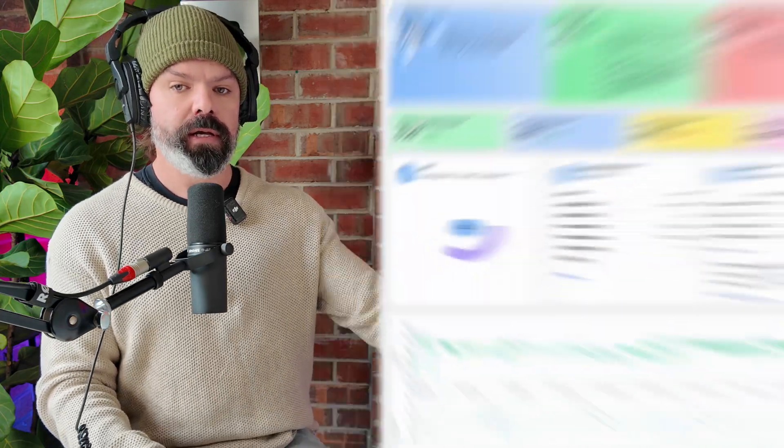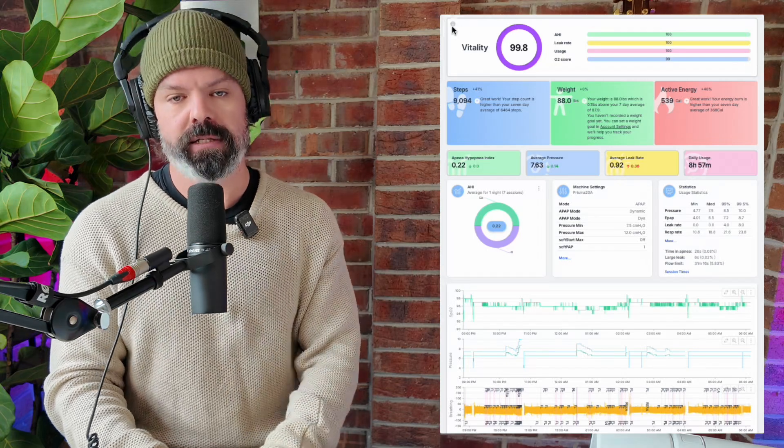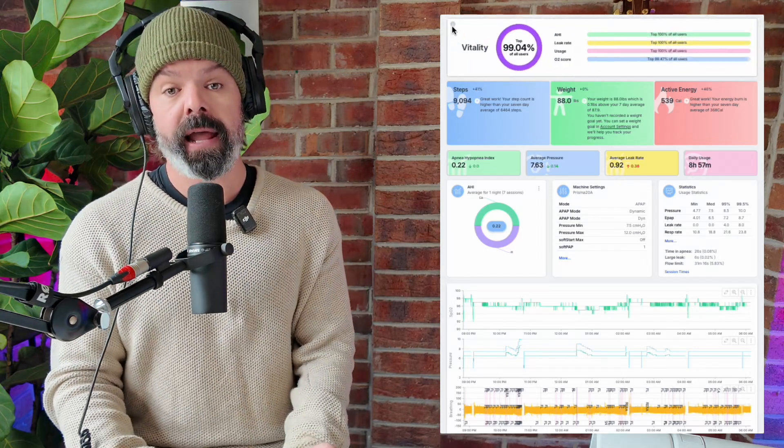G'day, my name's Nick, and today I'm gonna walk you through the provider menu on the Lowenstein Prisma Smart, or as I like to call it, the Stormtrooper. If you're new to CPAP therapy, the provider menu is where you'll find more advanced settings — things like pressure levels, comfort features, and other key adjustments to help you really dial in your therapy for the best results. And if you really wanna level up your CPAP game, this device is compatible with sleephq.com, so you can upload your data and get detailed charts and insights to really understand how your therapy is going night after night. All right, let's get started.